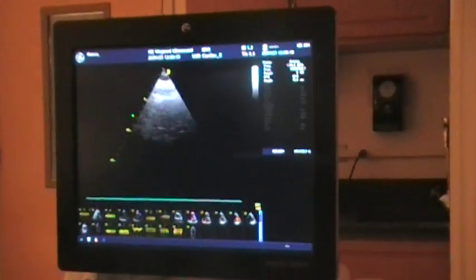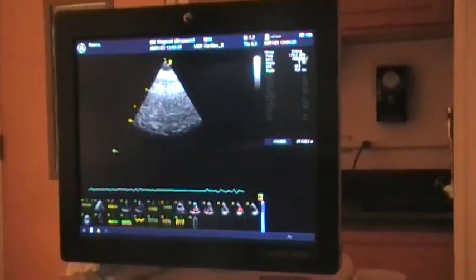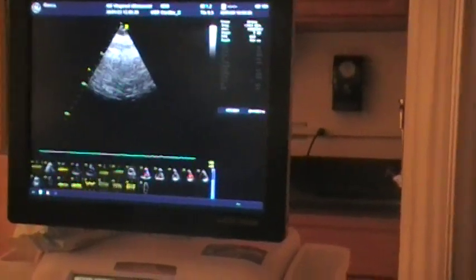So lay on your back for me. We're going to do subcostal. We're on the home stretch. Oh. Yeah, we can't completely cover you up here now. I'm just gonna go on top of your belly.